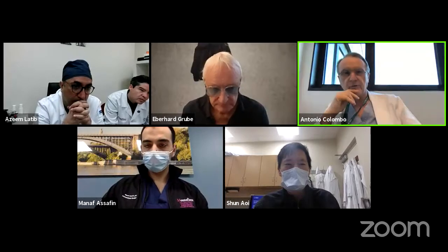And to the high pressure, I'm not enthusiastic to use 40 atmospheres. I'm always a little bit trepidant about vessel rupture, and I hate vessel rupture because it's a drama. I lost a patient because they had vessel rupture. So nowadays, with modern devices, you should minimize the need to go to 40 atmospheres. But if I have to go, I do IVUS first.